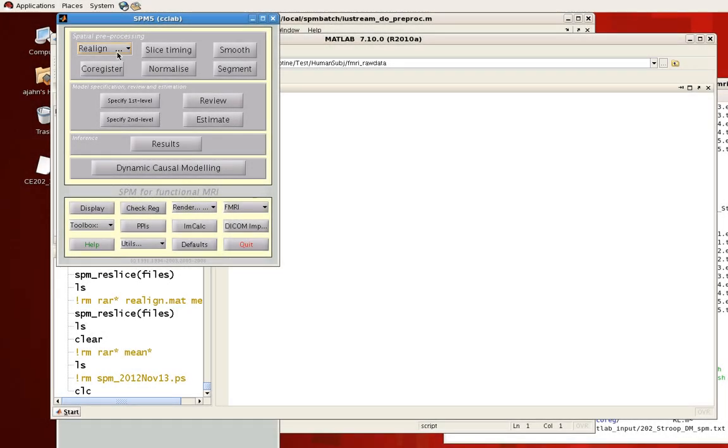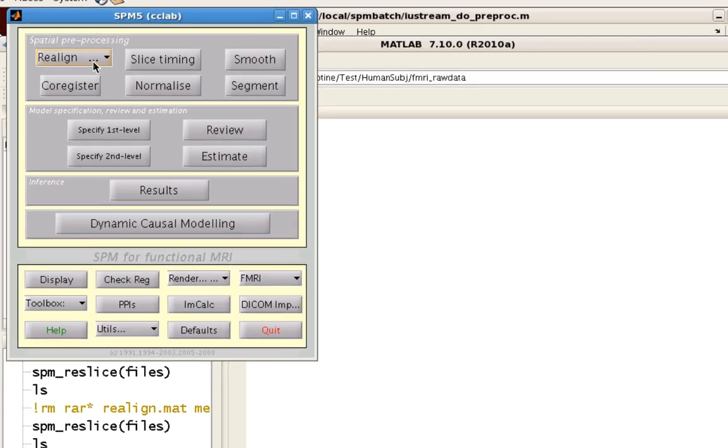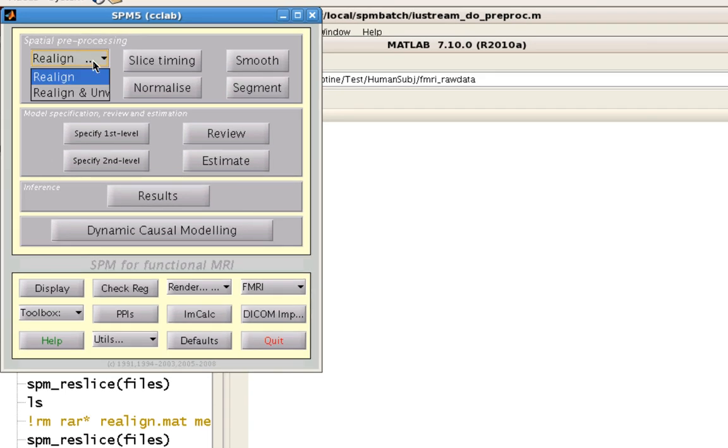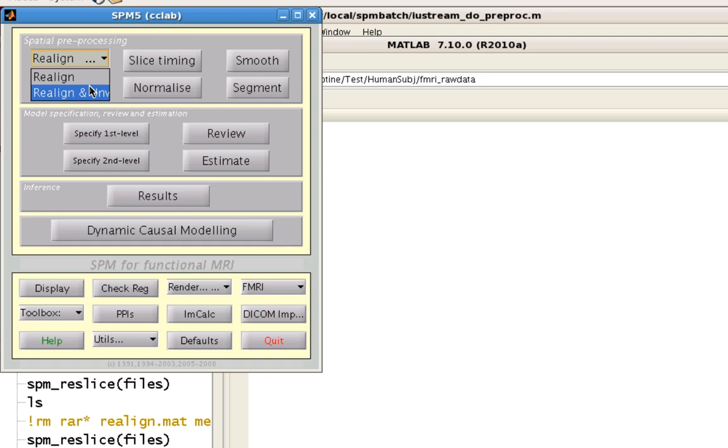In this demonstration, we're going to cover SPM's Realign tool. In this drop-down menu, you have both Realign and Realign and Unwarp options. If you have field maps which allow you to do unwarping, you can use them in Realign and Unwarp.